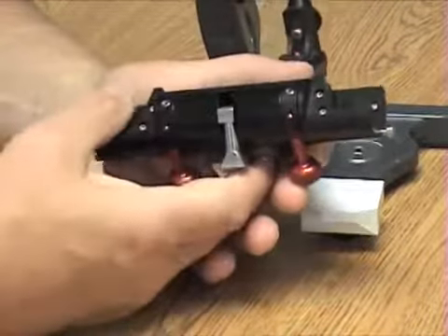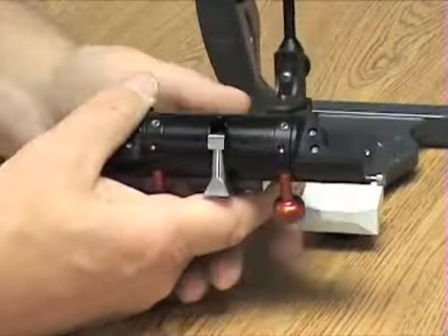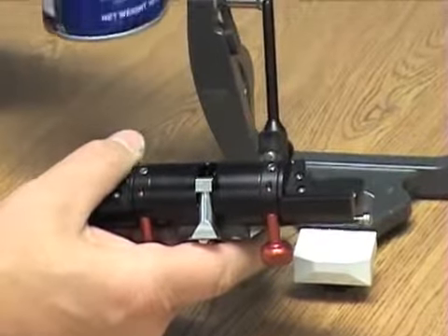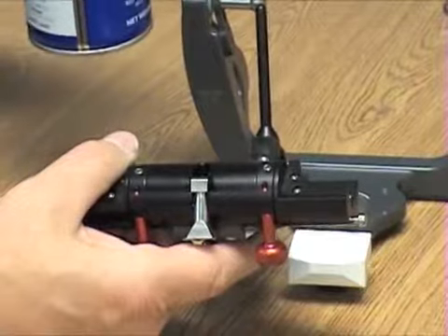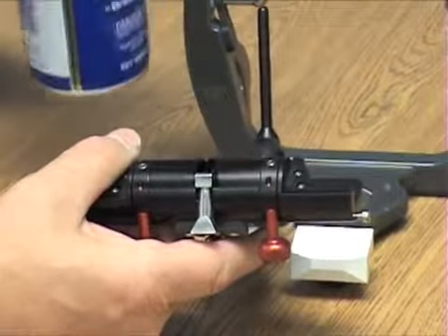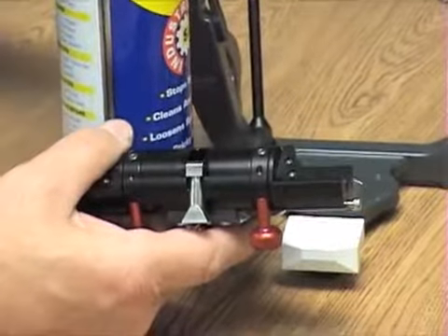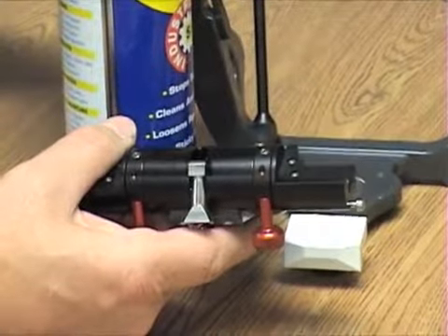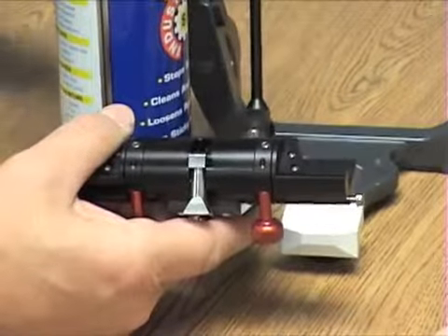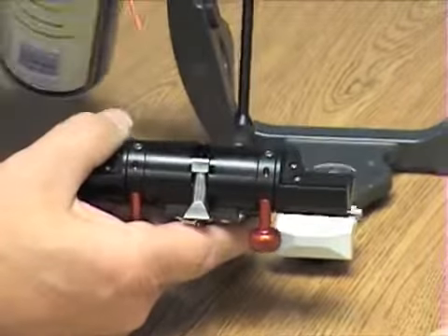What we're going to do is go into an unlatched position, and we have WD-40 here that we use. You can also use a high-speed handpiece oil, which you have in your office. But the WD-40 is handy because you can get it in a small can that makes it easier to handle. You probably won't use that little can up, it'll last you all year long, and it's not as big and bulky.